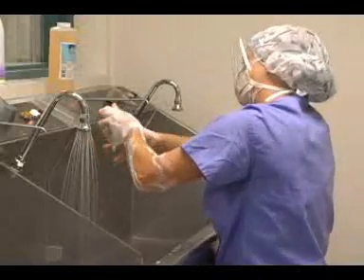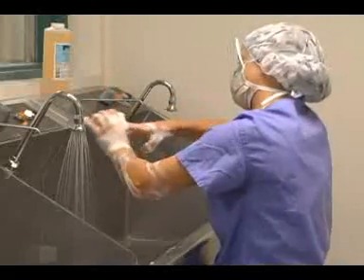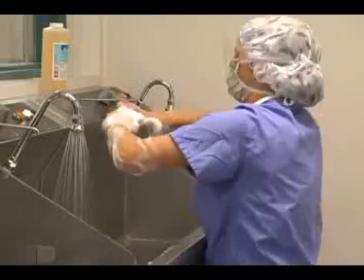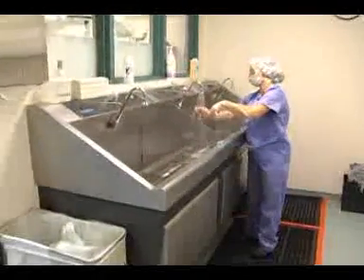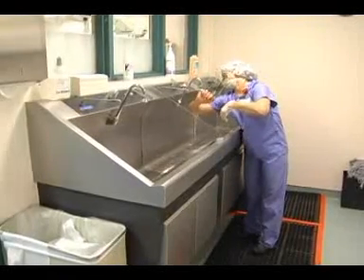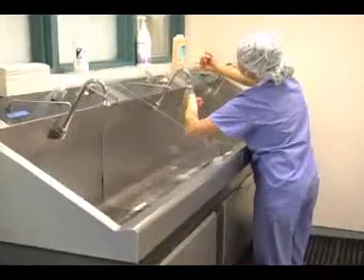Try to keep both hands elevated so that any runoff or water that drips down will move away from the hands and toward the elbow. Once the scrub is completed, she will discard the sponge and rinse each hand individually, starting from the fingers, wrist, down to the arms and elbow, being careful to keep both hands up in the air so any runoff drips away from the hands.